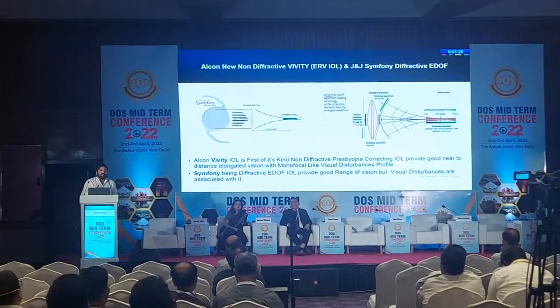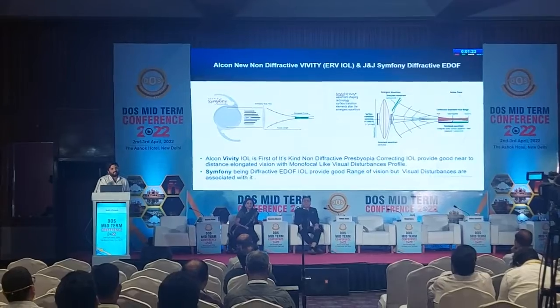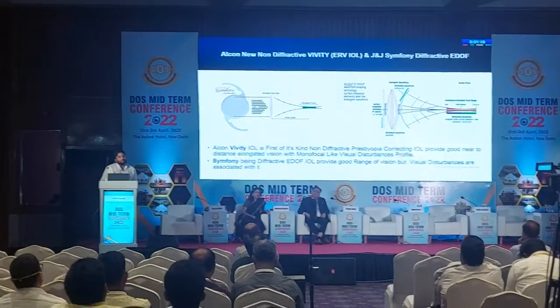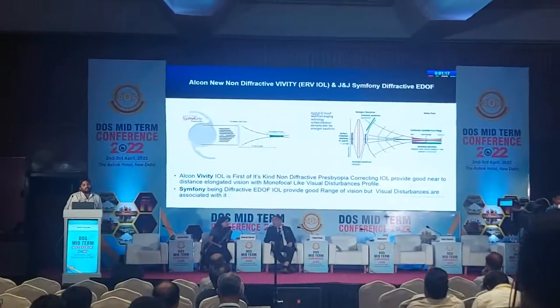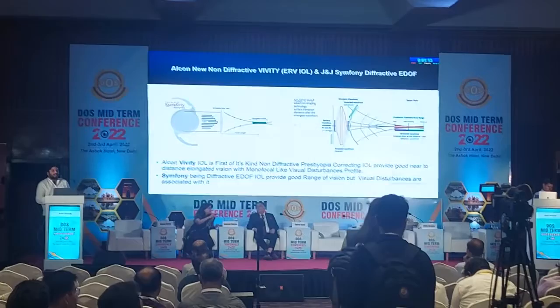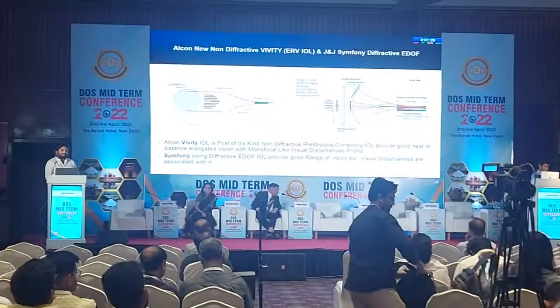Initially, in the first few weeks the near vision is much sharper, but we have realized that over a period of around 3 months, this tends to fall and the patient tends to require reading glasses. So we need to guard against that and not show too much excitement about near, especially in the initial post-operative period.